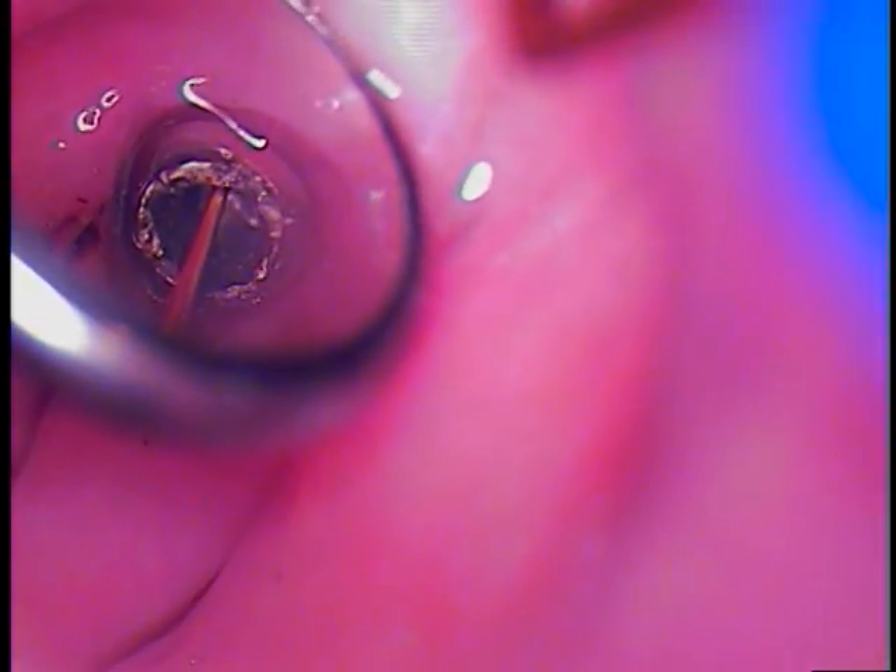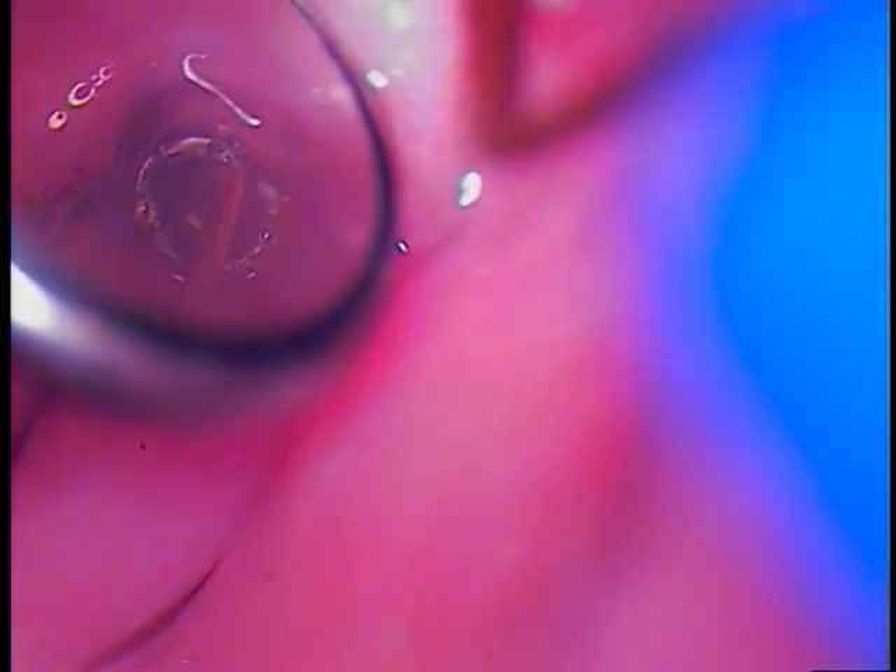We're finishing up here on the Strauman TL solid abutment. It took us probably a good hour and 15 minutes to drill through that hollow area. Once we made it through, I had to thin the walls of the solid abutment itself internally. Once I did that, I was able to fit just a simple composite instrument.